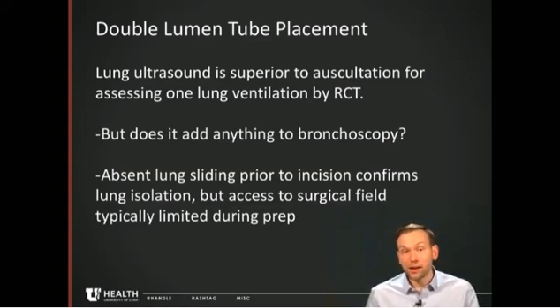That being said, like we saw with main stem intubation, which is really just a version of one lung ventilation, absent lung sliding prior to incision does confirm that your lung isolation is working, but there's some technical issues because you may not have access to the surgical field during prep to actually get your ultrasound probe on the chest. So these are just ideas that are out there, probably not game ready here.